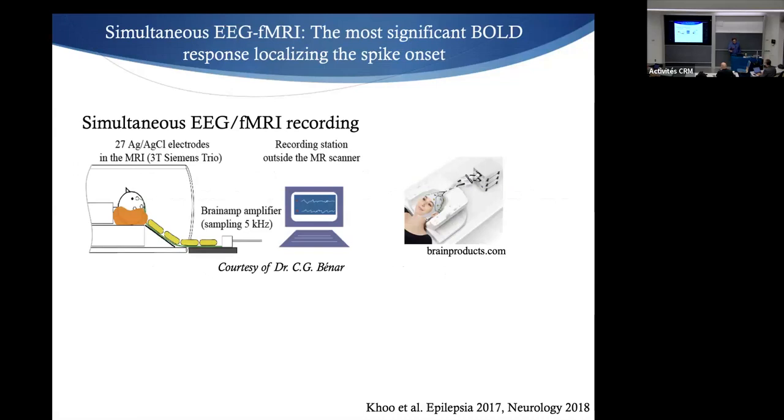So I talked a lot about EEG and MEG this morning. I'm going to talk briefly about that one, which is measuring EEG in the worst ever environment where you want to record an EEG, which is an MR scanner. As you know, you are measuring electric activity with electric wire, and if you move wires inside a huge magnetic field, you're going to get lots of artifacts. But we know how to handle that.